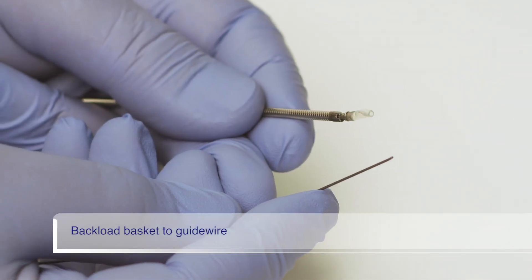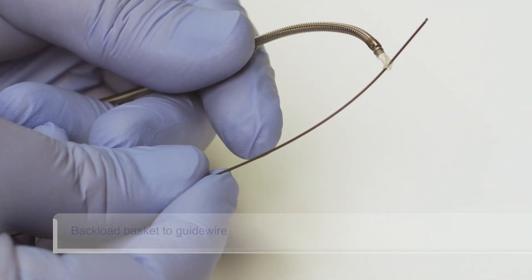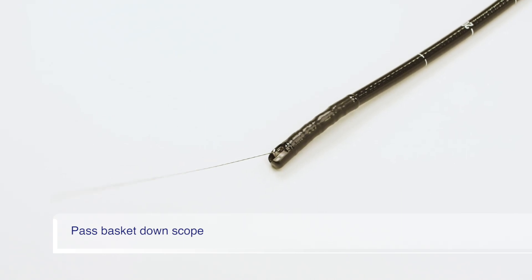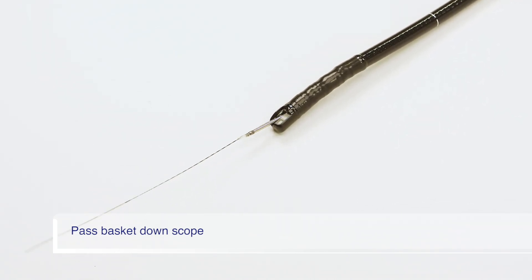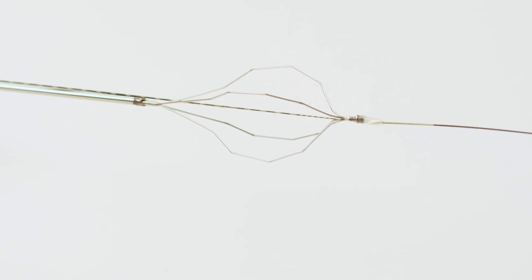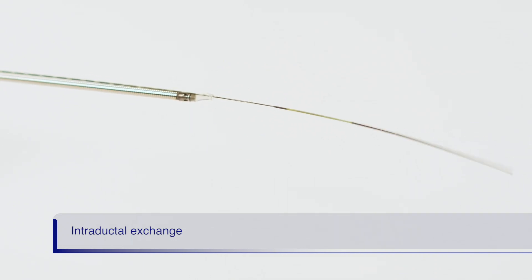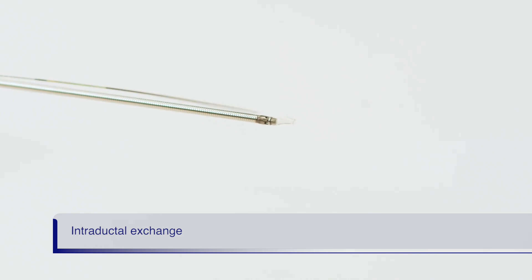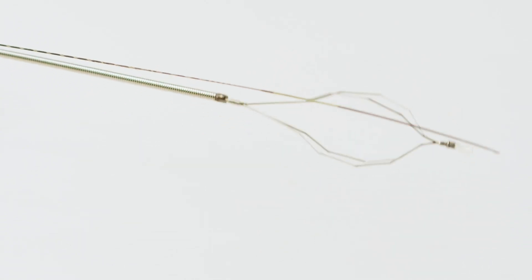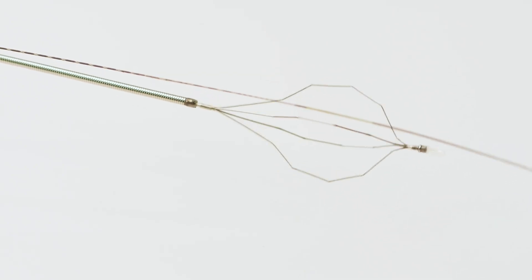Backload the distally wire-guided basket tip onto a .035 inch or smaller guide wire. Pass the basket down the scope along the guide wire into the patient's duct. The distally wire-guided tip enables the basket to cannulate the duct by following the guide wire. Once in the duct, to allow for full basket rotation, separate the guide wire from the basket tip by performing an intraductal exchange. This is accomplished by slowly withdrawing the guide wire while advancing the basket until the guide wire and basket are separated inside the duct. Now the basket can be fully rotated without being caught in the wire, and the wire can maintain ductal access during the entire procedure.